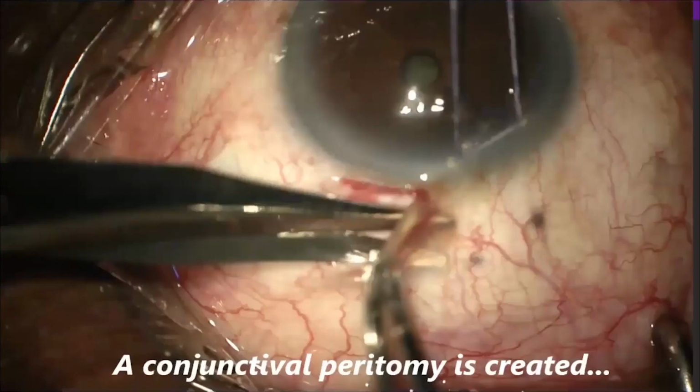So let's go step by step. We're going to make a conjunctival peritomy. And like I said, I personally like about a 4 clock hour peritomy at first. You can maybe make this a bit smaller as you get more comfortable making the needle track into the eye. I often make a relaxing incision on one end and then continue my dissection across, trying to make sure that I stay behind Tenon's when I start my initial dissection.